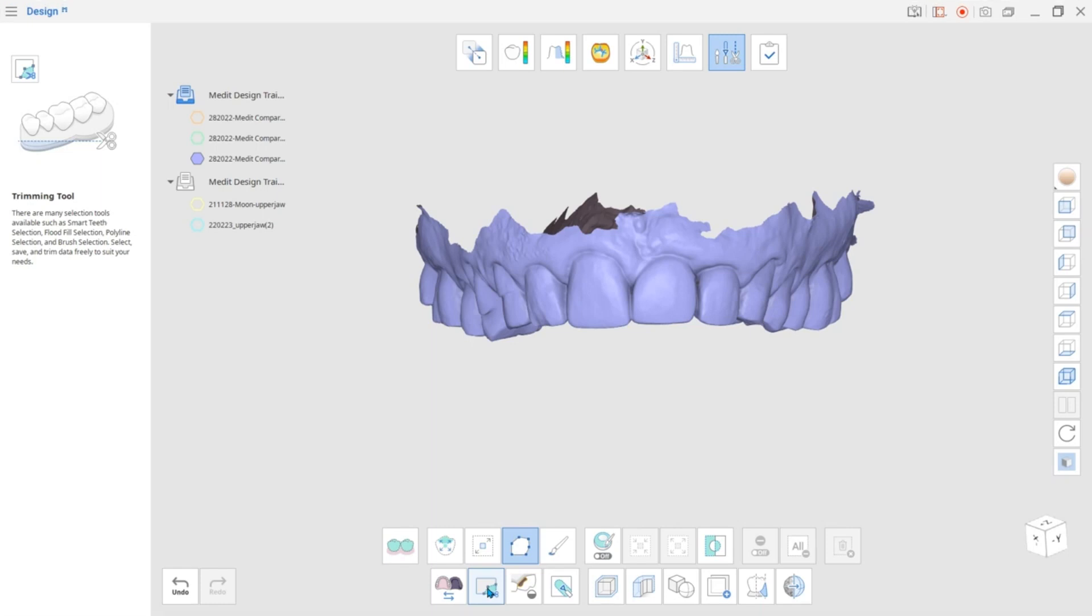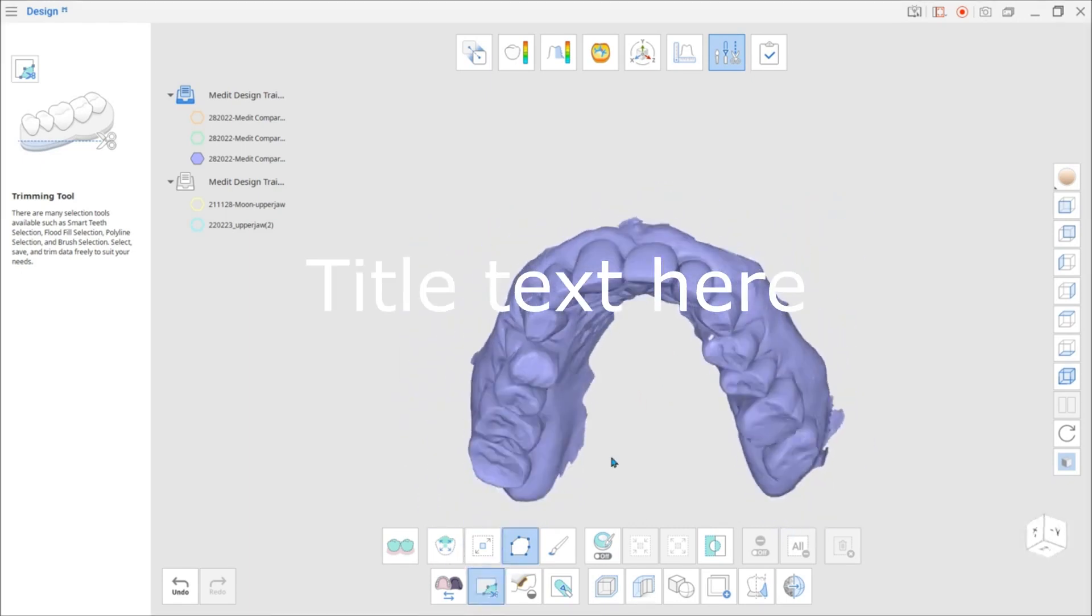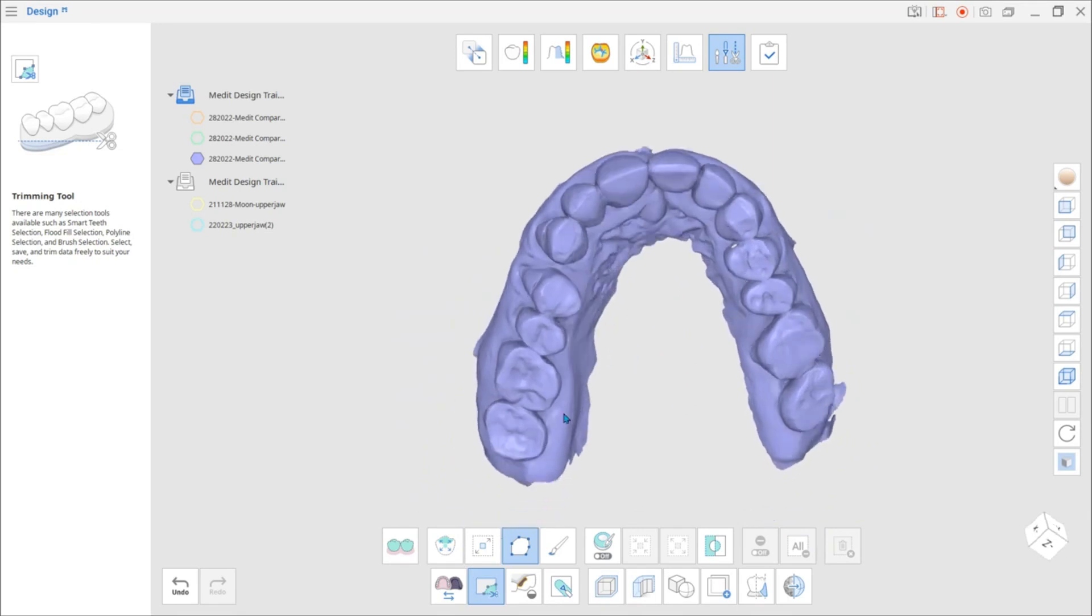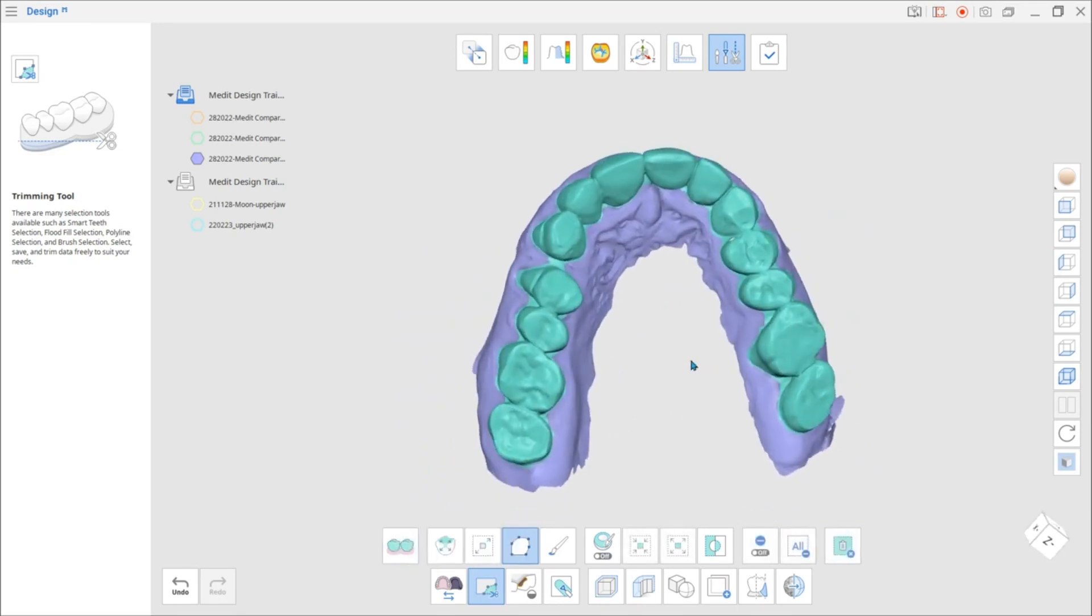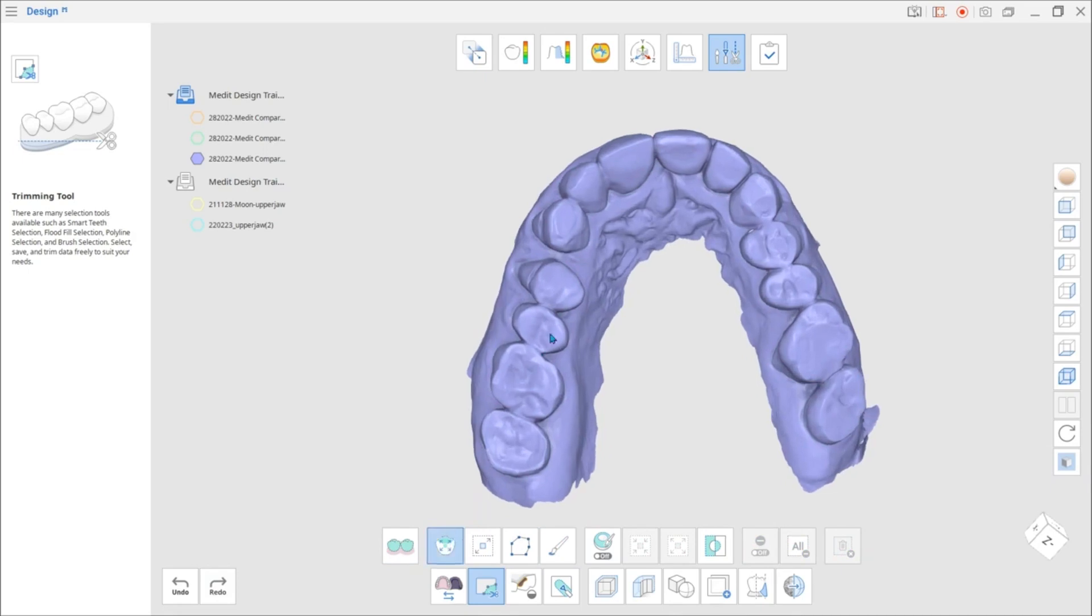Let's look at some of these selection options. The first one is Smart Teeth Selection. Use this option to automatically select all teeth and leave out the gingiva. Note that this function is available only if the data was acquired by MeditScan for Clinics.